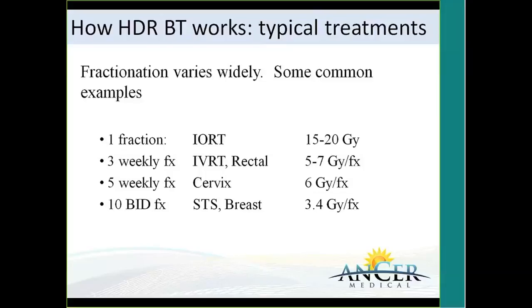What we're doing with the E applicators, we're placing the source outside the target, and we're aiming the radiation into the lumen. So it's not always an interstitial treatment. It can be an intracavitary treatment. It can be a surface treatment, but it's always very close. So you deliver a high dose to the target and hopefully a lower dose to the critical structures.